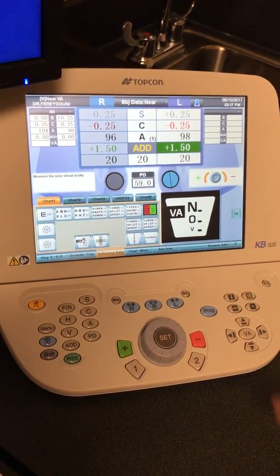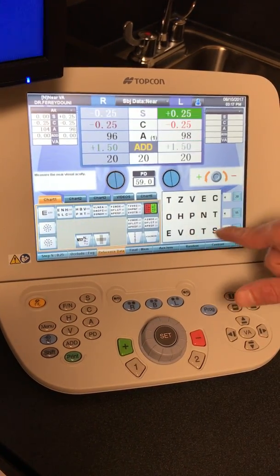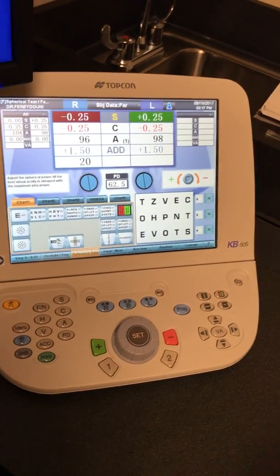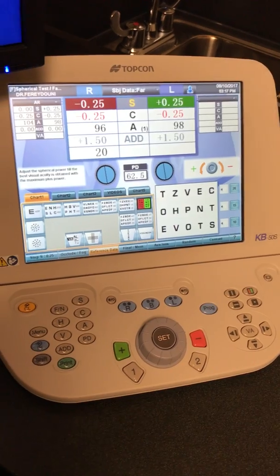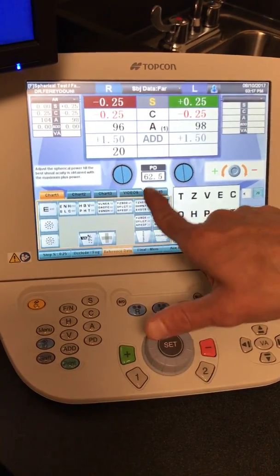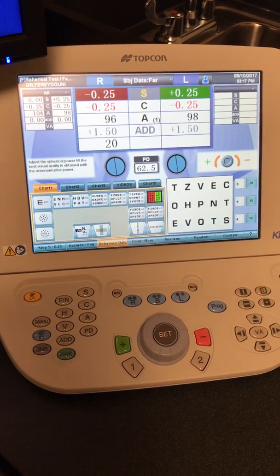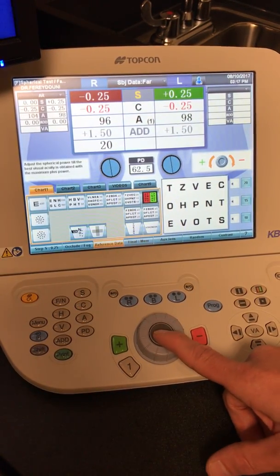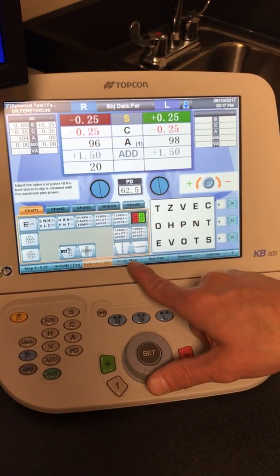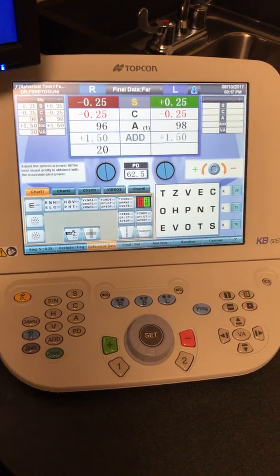Once that's all complete and you're finished, you just hit set again. It will bring the VA chart up again, and this would be the time to do more testing — whether you're going to be doing phoria testing, vergence testing, or even working on prism. There are other charts on here, so if you're moving out of the program, you can hit onto a different chart, say for instance FCC or something like that. When you are finished, you would hit final, and it sends it to the memory. All that data is sent over to the memory.